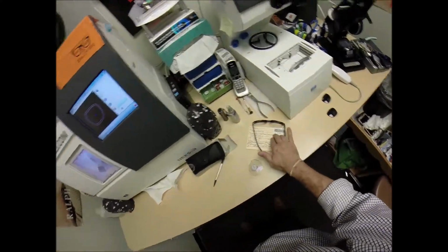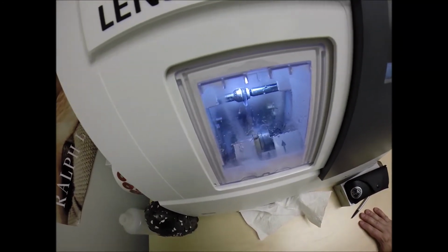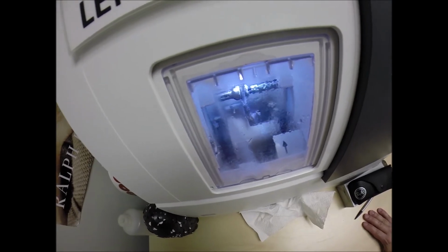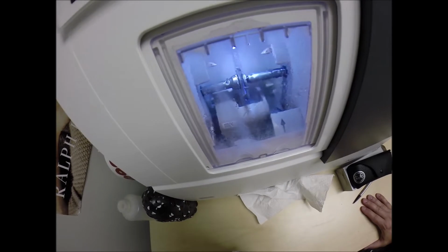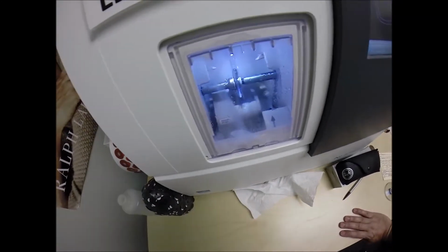Now once we get the final size down, I will write that on your paperwork so years from now, should you ever need new lenses, I'll know exactly what size to cut these and ship them. Now the right lens takes the longest. Once we get the right lens down, we'll flip it over and start cutting the left. Unless you have some crazy difference, it'll be the same for the left.